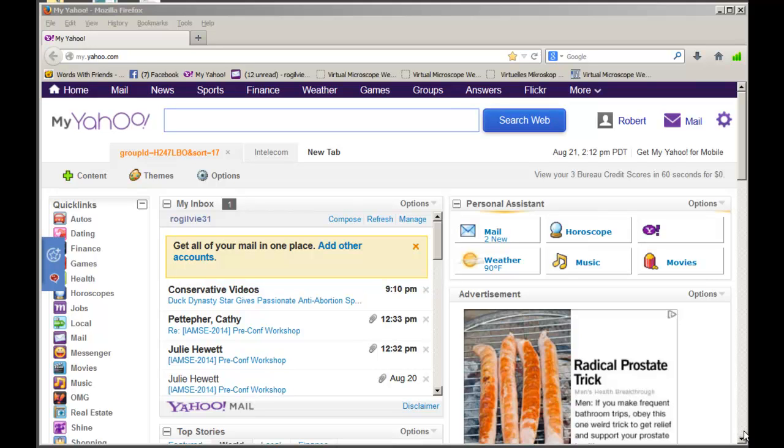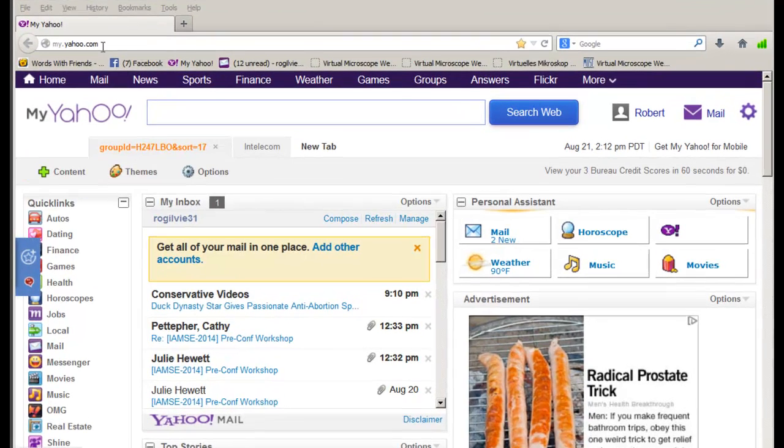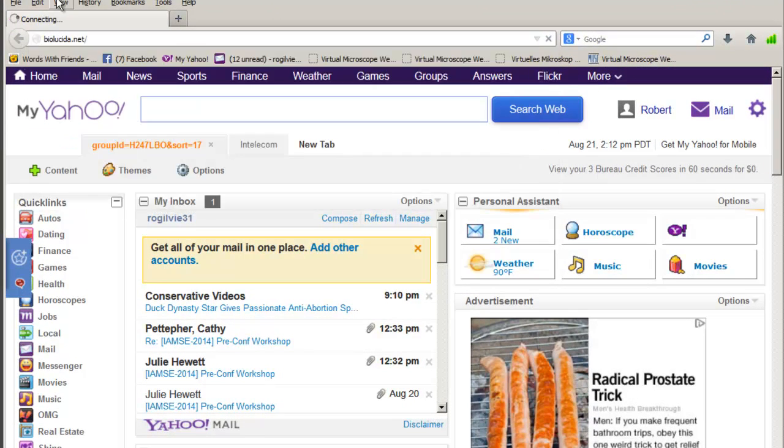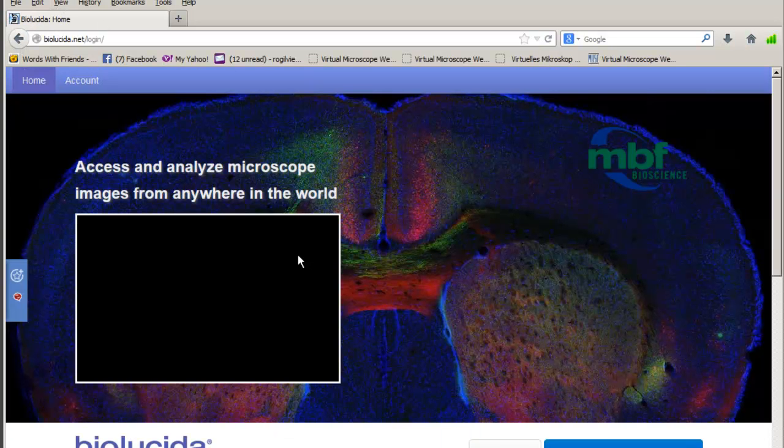This video, made by me, Dr. Ogilvy, for the histology class, fall 2013, is going to walk you through downloading the Biolucida Viewer from a website that I'm going to type in here right now, and this will follow along fairly closely to the instructions that are put on the website.